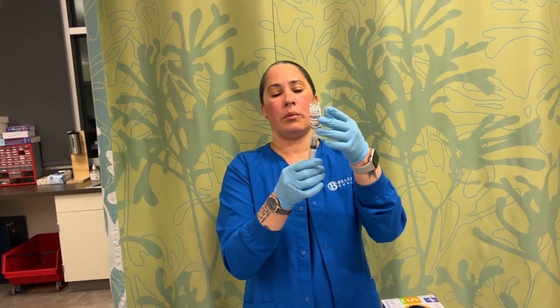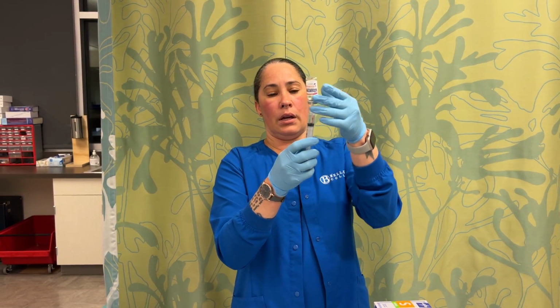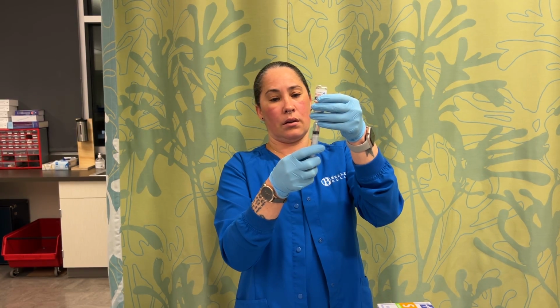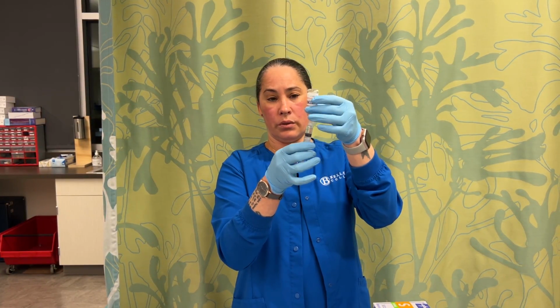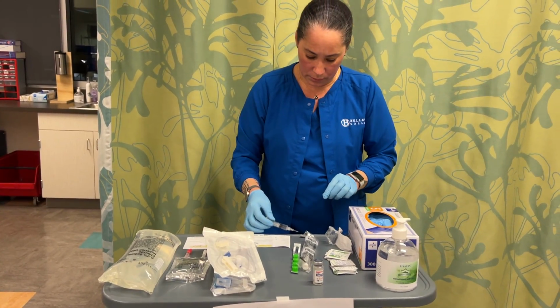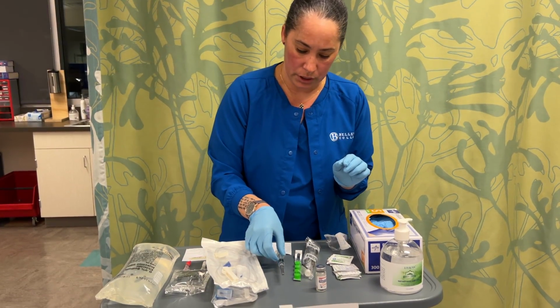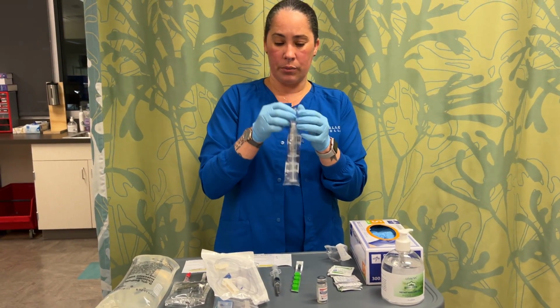Make sure there's no bubbles because you don't want to put bubbles in your patient's IV. That's not good. All right, so we have our 2 mLs. And you just don't want to stab yourself here. So here's our medication. And then you're going to grab your saline.